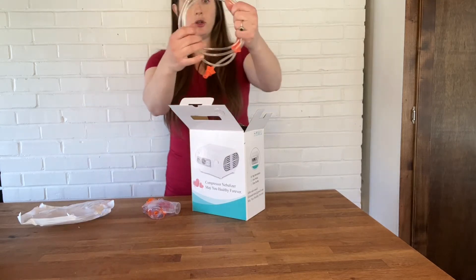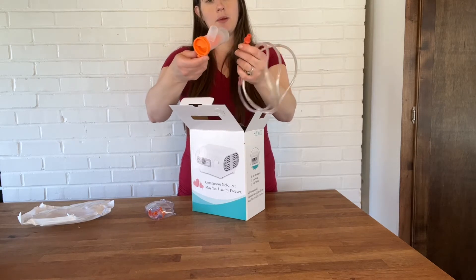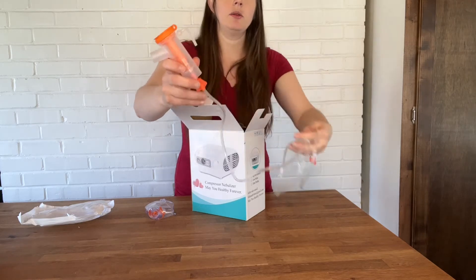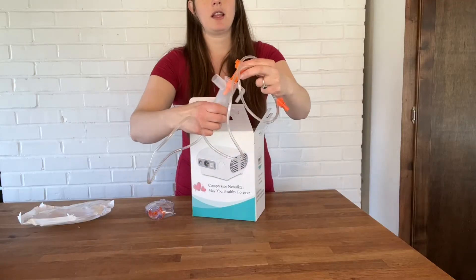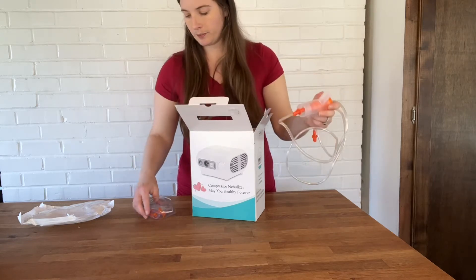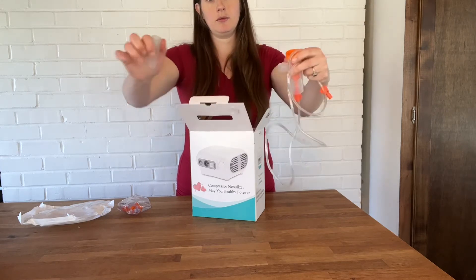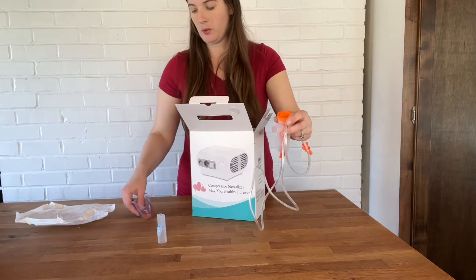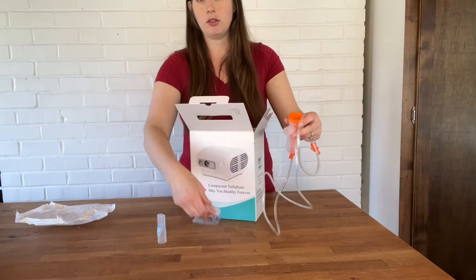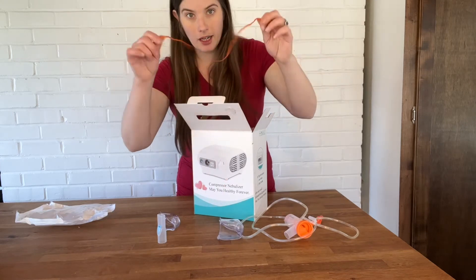You have your tubing that's going to connect the machine to the medicine cup that's going to attach on the bottom right there like so, and you have a little meter there. This comes off to put your medicine or your water in, and then you can attach either a mouthpiece or you have two different sizes of masks — one for adults and one for children.